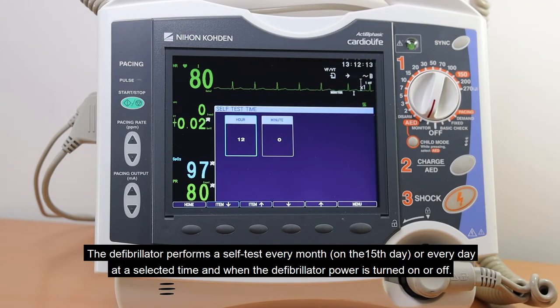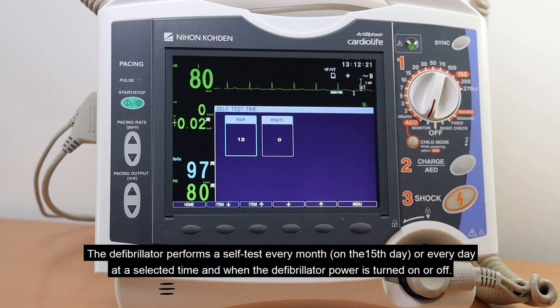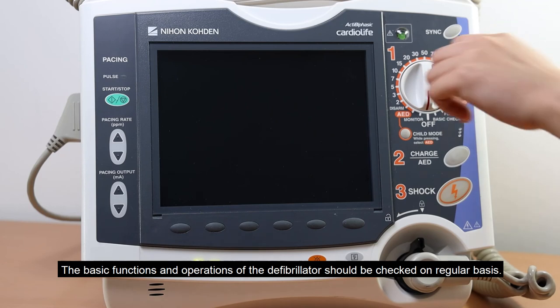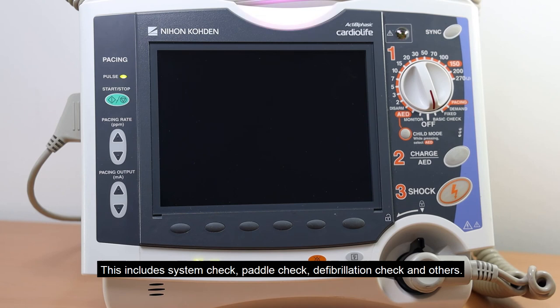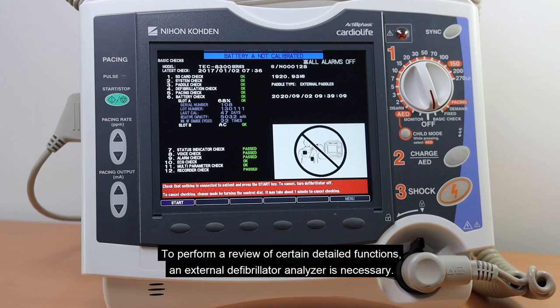The defibrillator performs a self-test every month on the 15th day, or every day at a selected time, and when the defibrillator power is turned on or off. The basic functions and operations should be checked on a regular basis, including system check, paddle check, defibrillation check, and others. To perform a review of certain detailed functions, an external defibrillator analyzer is necessary.